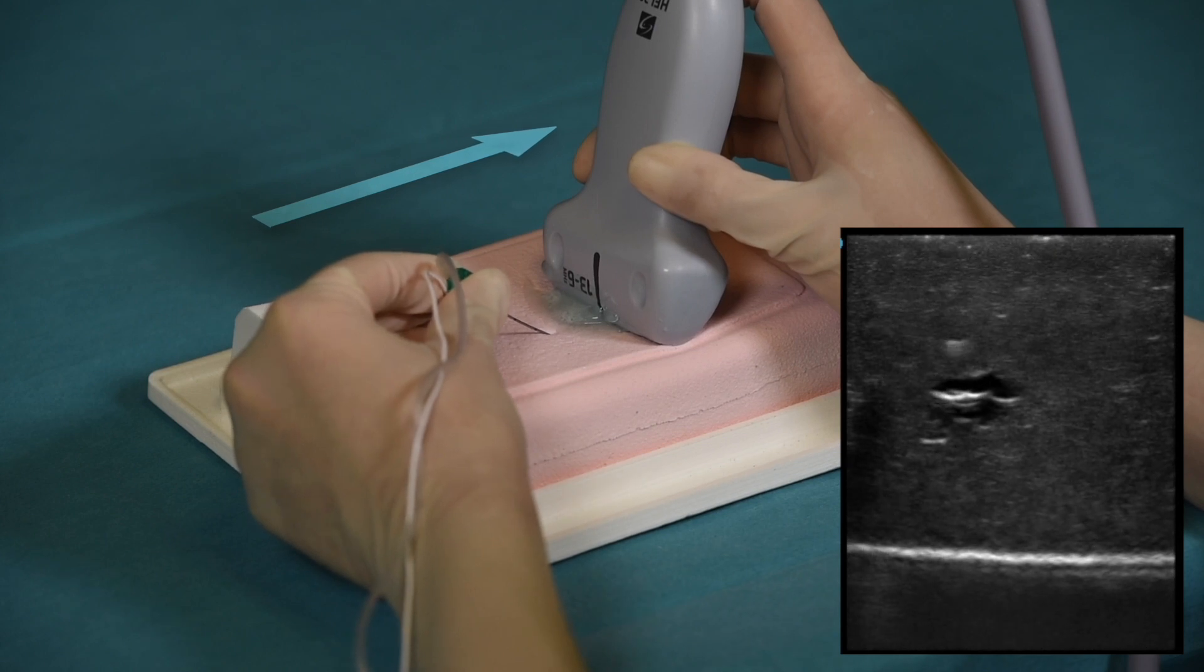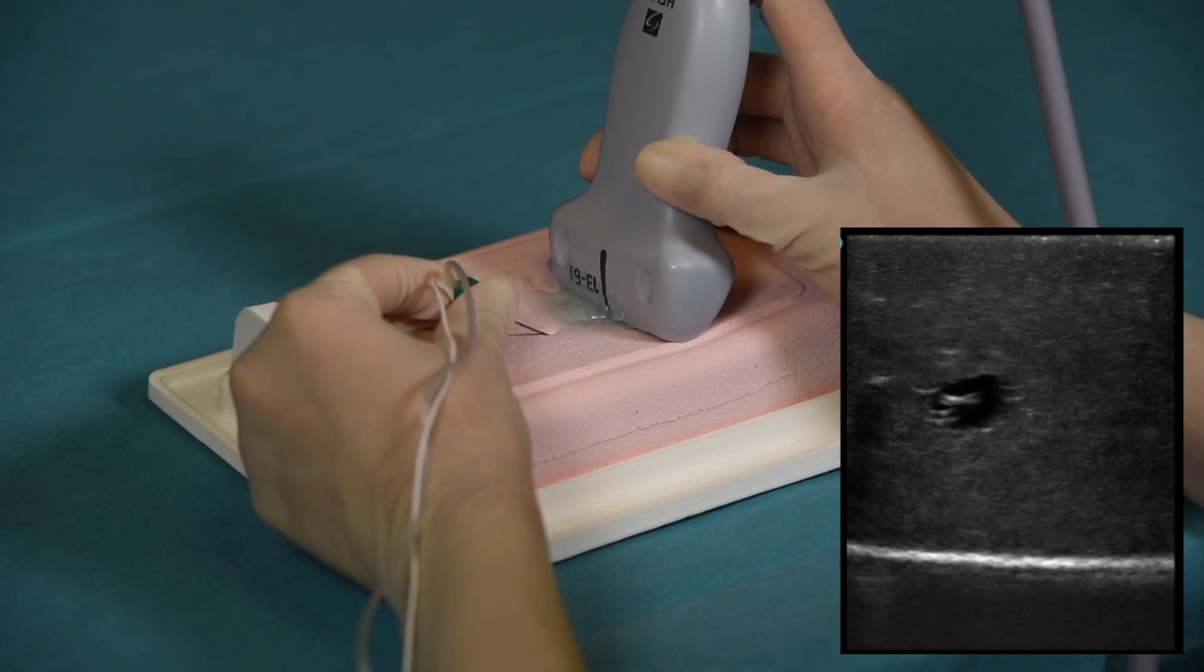A small correction of the needle angle is required for the needle tip to enter the blood vessel.